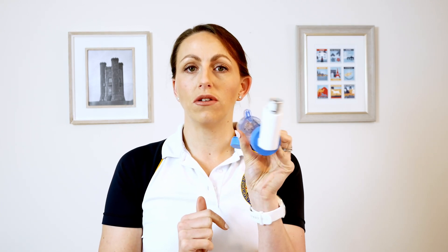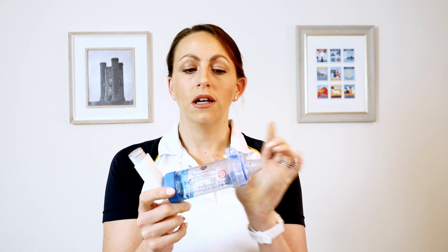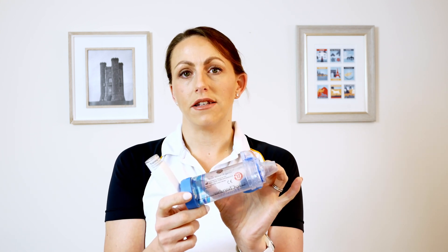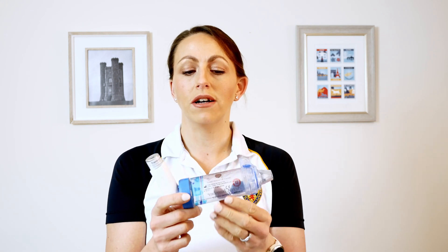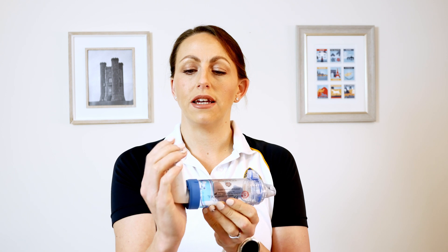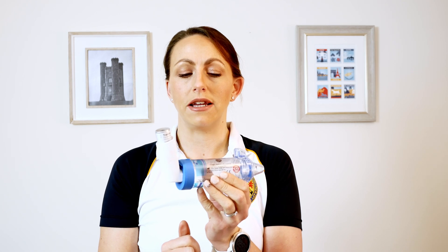You then deliver your dose into the spacer. You can do that with your mouth already sealed, or you can do it before, because it will hold the drug for a little while — there's a valve inside so it's not going to just disperse out. If you've got dexterity issues and find it hard to hold the inhaler and press it at that angle, you could press it in a different way — however it works for you — and pop the dose into the spacer.